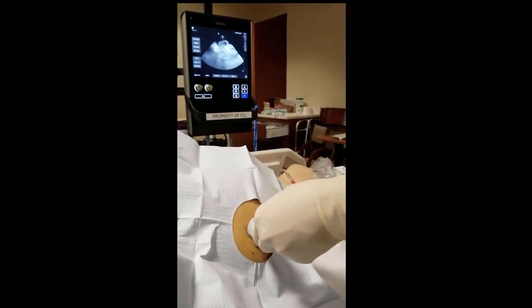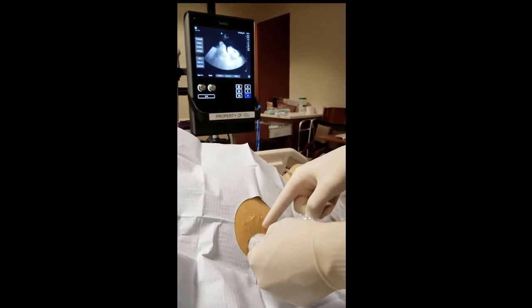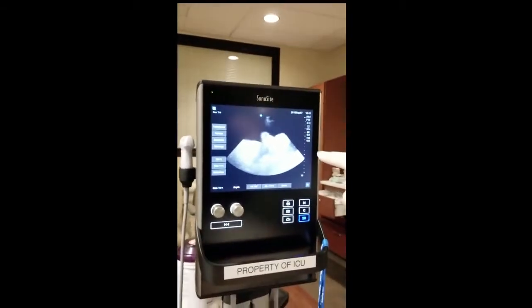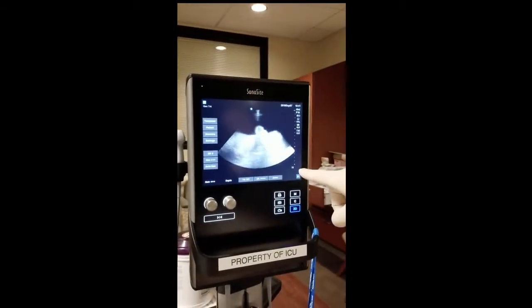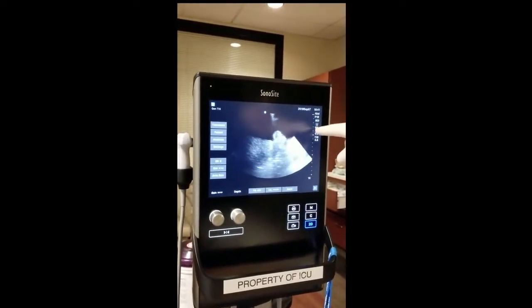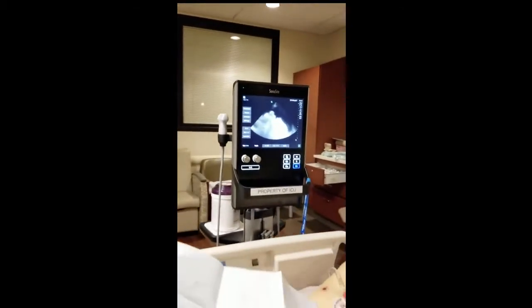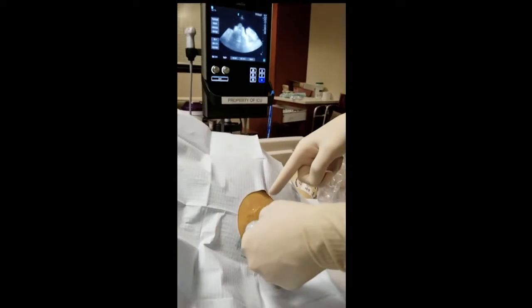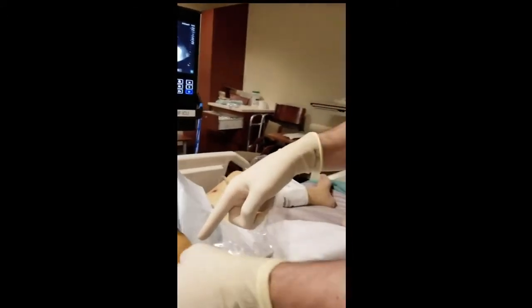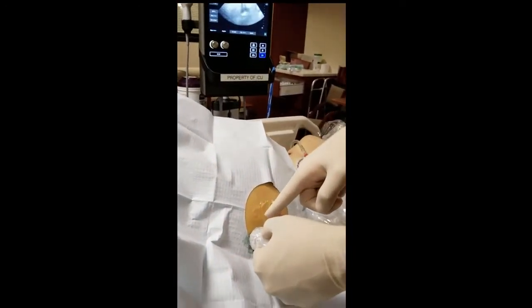Now I'm going to take a look and find a spot that I think would be good. I see a spot right here, and if you look at the screen you can see what I'm looking at. Up here is a little bit better — from here to here and then over to the side, I have about an 8-centimeter pocket right here. I could move around and get a different area, but they're all relatively similar. I'm going to choose this one because it's a little deeper right at this area here.